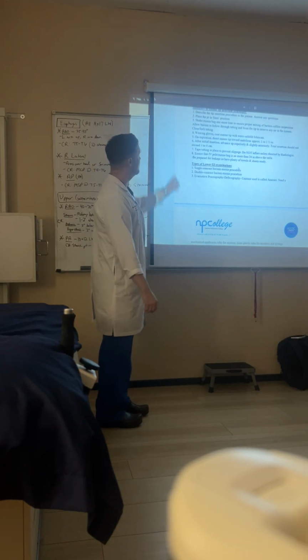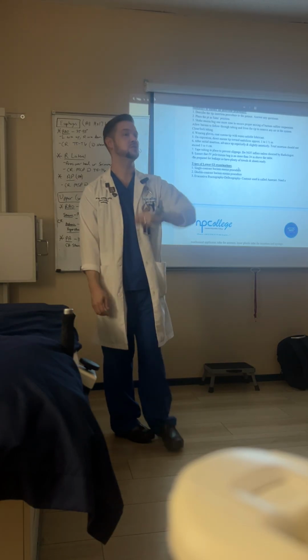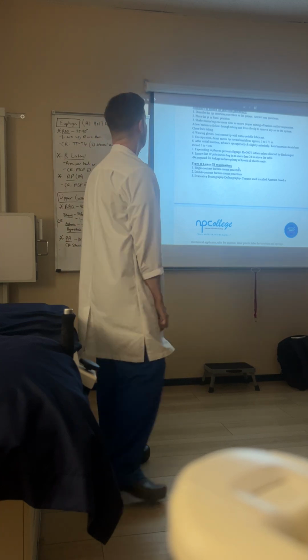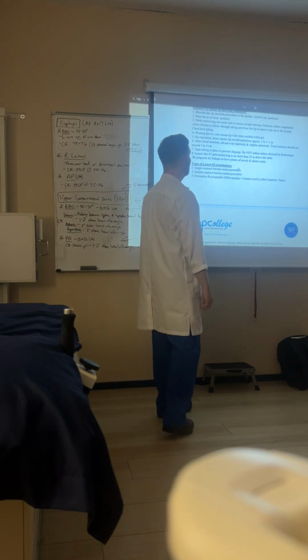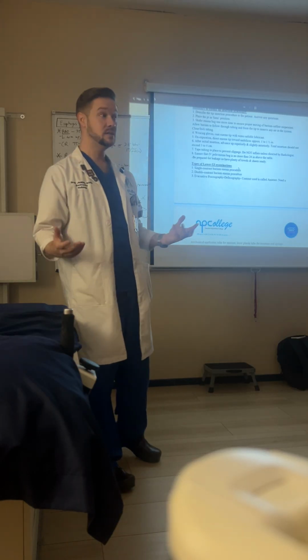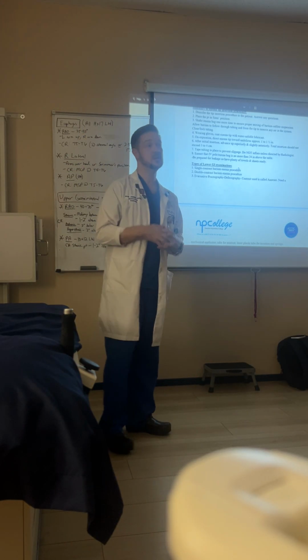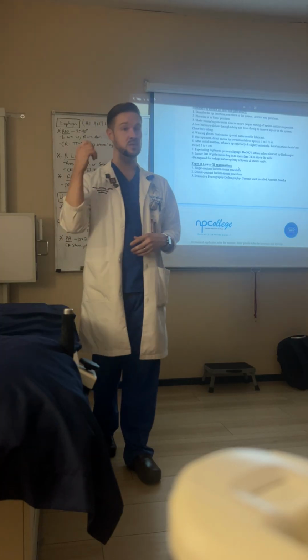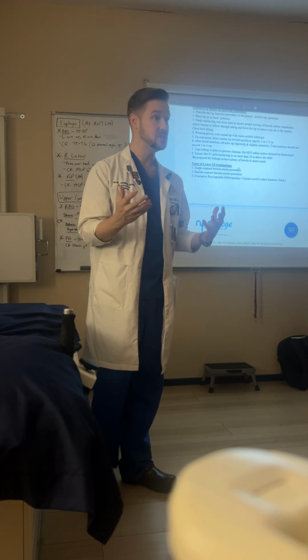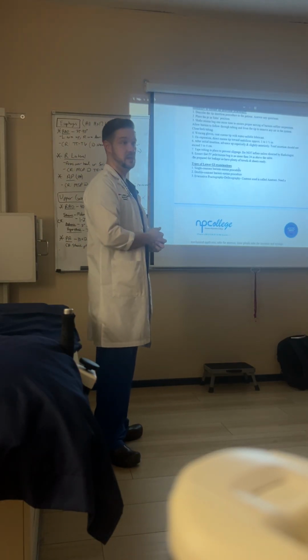Okay, so summary of enema tip insertion procedure. We're going to describe the tip insertion to the patient. We're not just going to do it. Hi, surprise! We're going to tell them what's happening. Answer any questions. This can be a very sensitive and kind of scary thing, right? We want to tell them everything that they're going to feel, everything they're going to experience. First, they're going to feel a little cold as we put the water-based lubricant on the outside of their body, right? They're going to feel that. Then they're going to feel a little pressure as we insert the tip, okay?